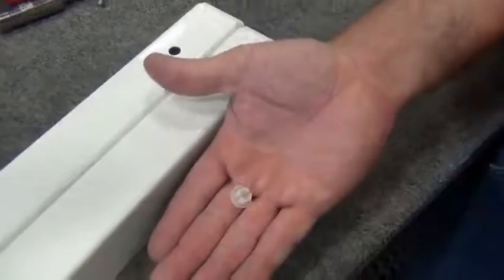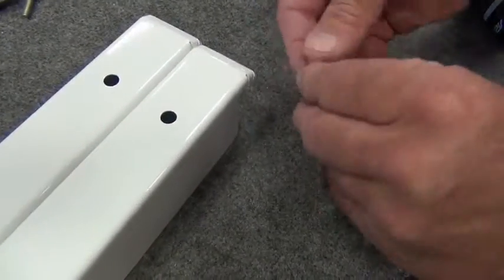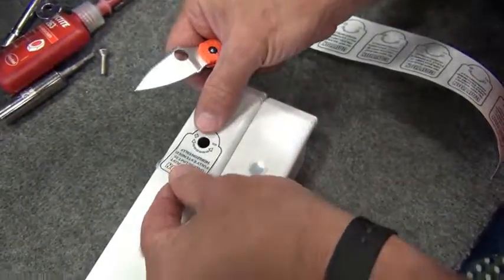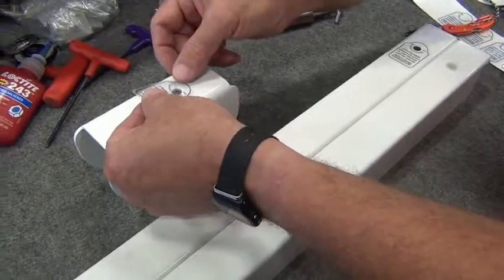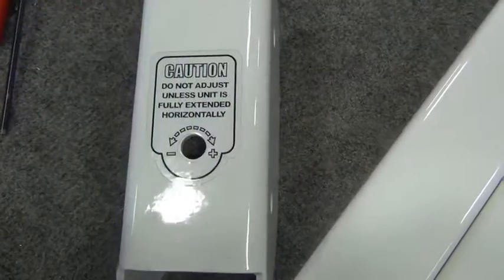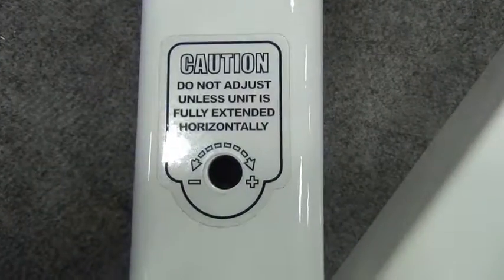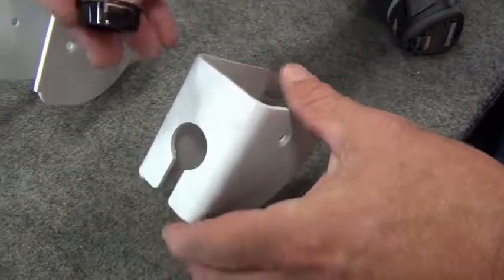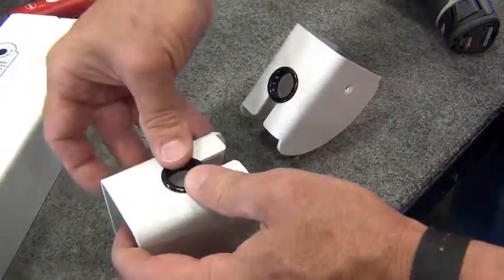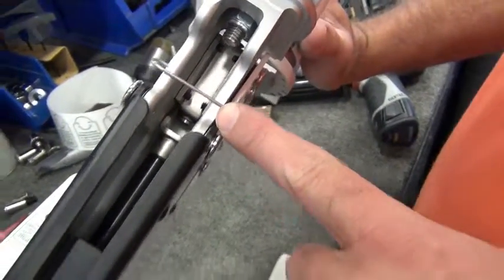A hole plug is inserted into the arm cover that will be attached to the bottom of the Elite arm. A warning sticker is applied to the arm cover that will be attached to the top of the arm. Grommets are inserted into the end covers to allow smooth movement of cables. Make sure cable retainers are attached.